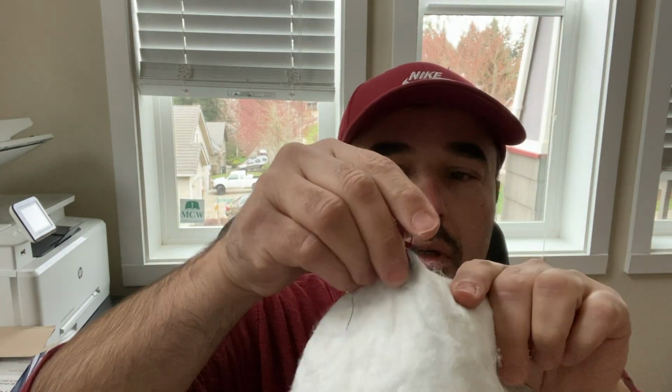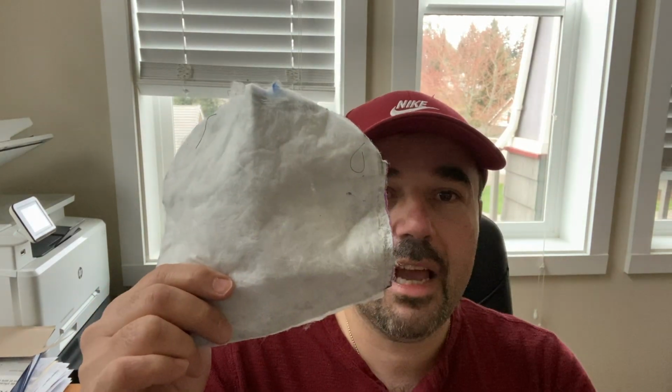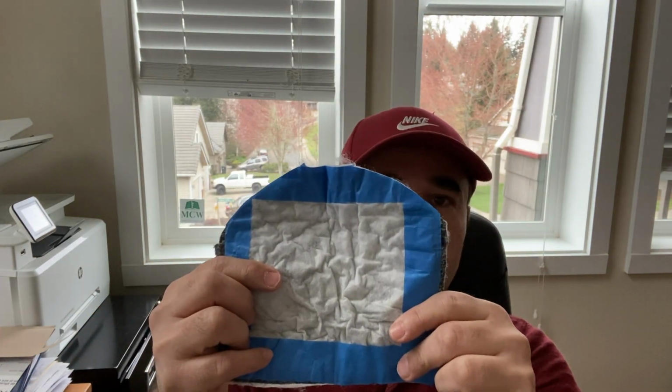Okay, once you're happy with that, and you know this is going to be what you need, what I recommend is that you stop at this point and go make yourself a template of this. So now you know what size you need, whether it's 7-inch, 6.5 inch, 7.5 inch, whatever it is, go make a master copy of this, because you don't want to have to do this each and every time. All right, so go do that. Okay, after you've made your master, now you're going to go ahead and complete this one.